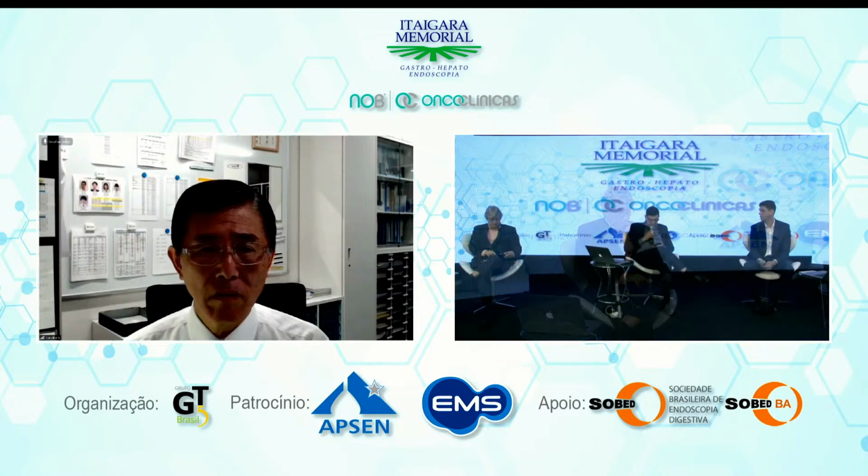At present, even if endoscopists use NBI magnification, BLI magnification, IEE, not so good accuracy is obtained to conduct the resect and discard strategy. The resect and discard strategy is now a distant purpose, not practical.